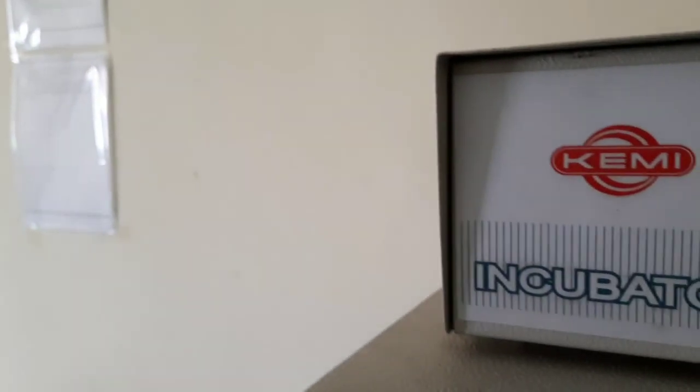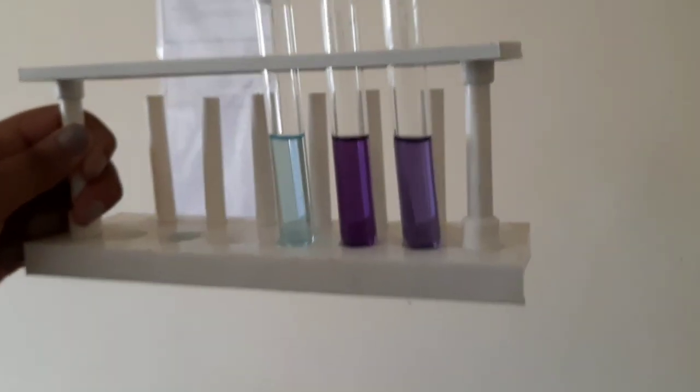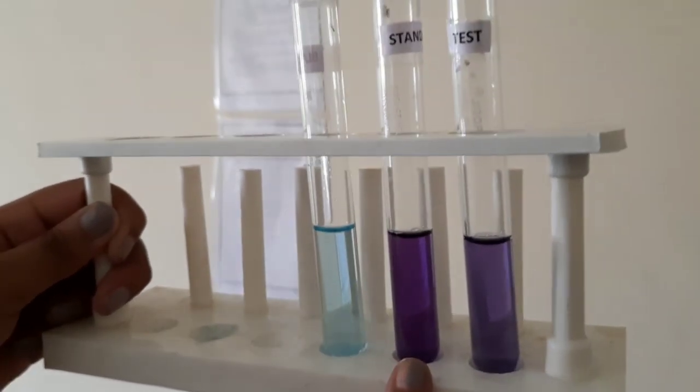Now we are going to incubate it at 37 degrees Celsius for about 10 minutes. It's been 10 minutes of incubation. Now we are going to take out the tubes. So now you can look for the color change.